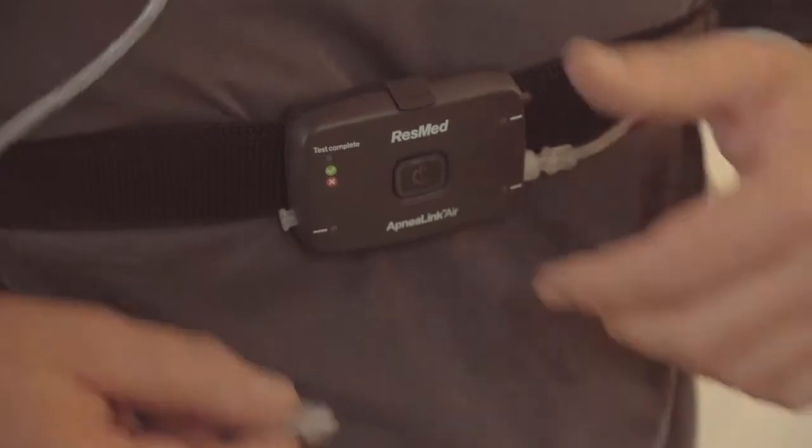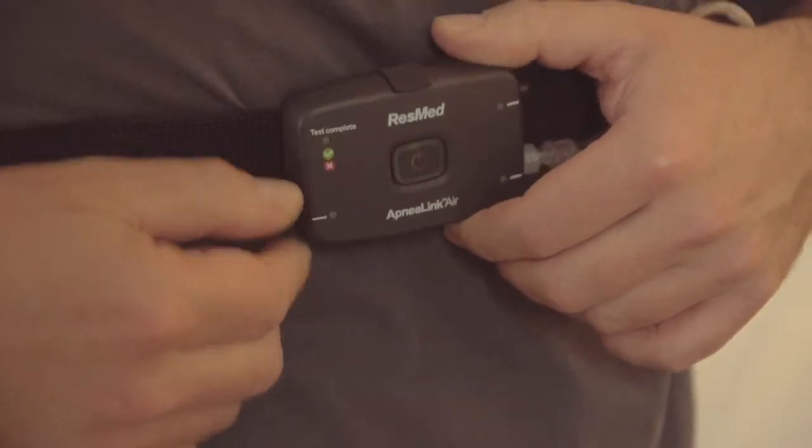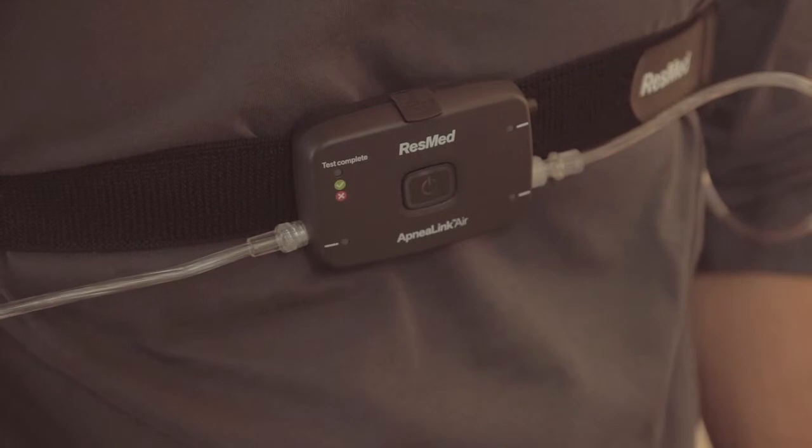Insert the end of the nasal cannula into the recorder, turning it clockwise. Your healthcare provider may already have done this for you.